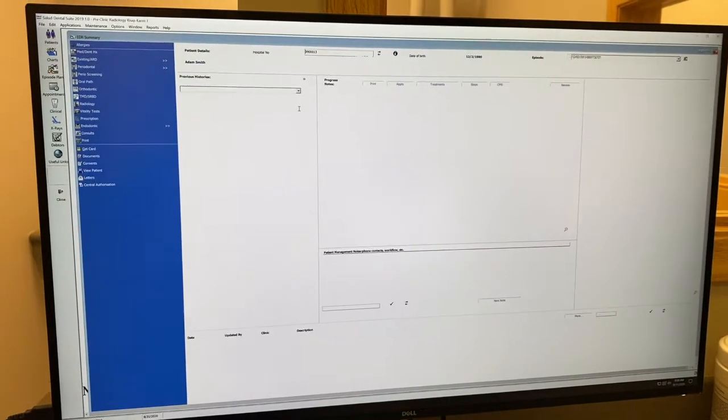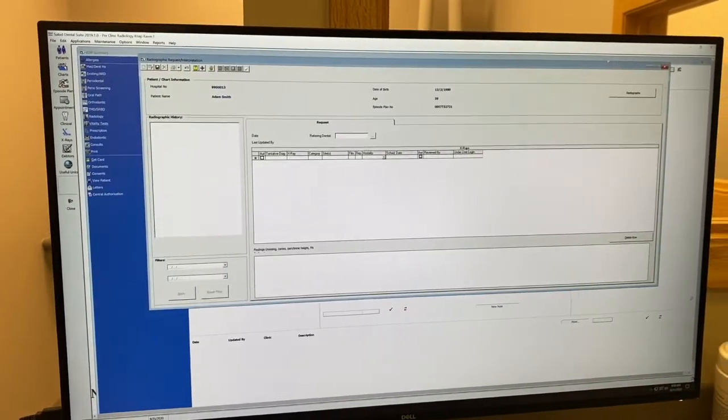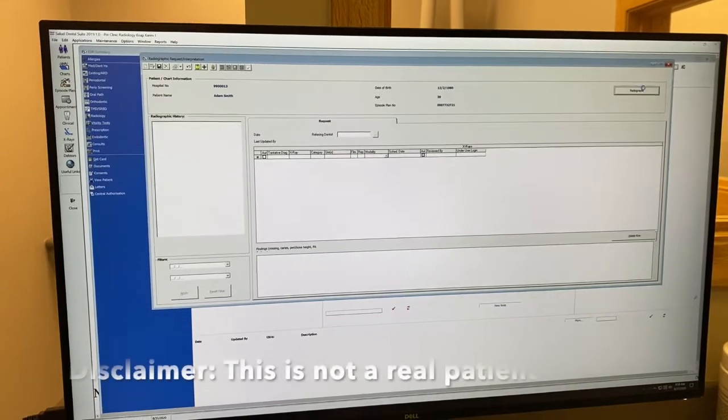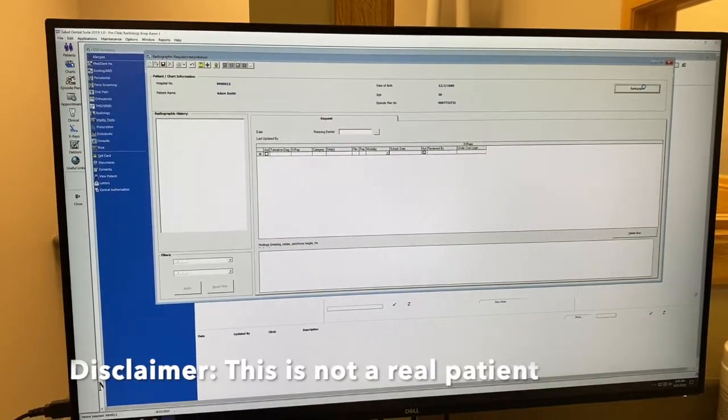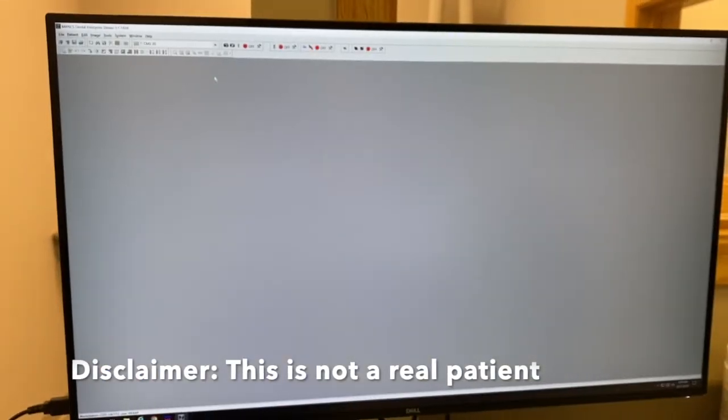Prior to being in the radiology lab, clinic instructors will authorize you to take an x-ray for the patient. Log into SOLUDE using UNMC credentials to access the patient's files. Once inside the chart, click radiographs to view the patient's previous x-rays.